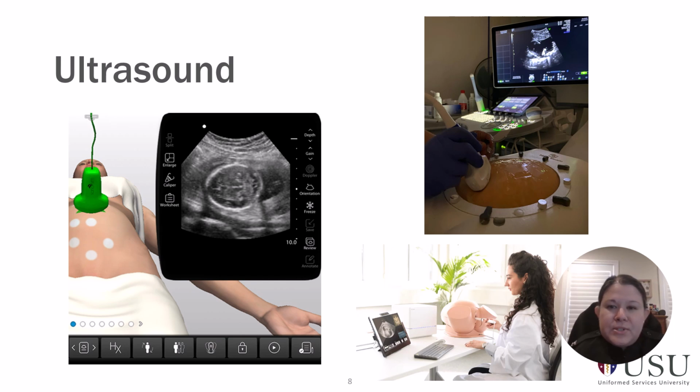Another opportunity for procedural simulators in obstetrics and gynecology is ultrasound. So this is a skill you can certainly practice in an apprenticeship model on actual patients, and we do some of that. But I think it's kind of nice for students, residents, and people who are learning ultrasound to have additional opportunities, including ultrasound simulators. So I've shown a couple here.